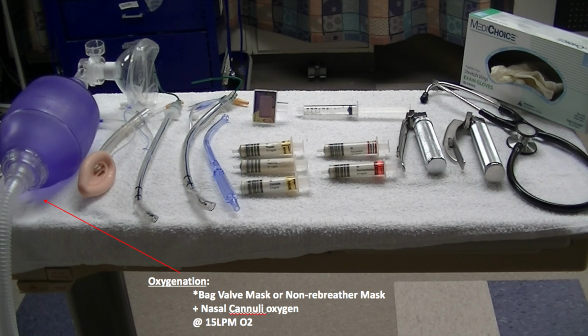In addition to this, you should place the nasal cannula on the patient and have oxygen cranked to its maximum at 15 liters per minute. Using a nasal cannula in addition to a mask will allow you to maximize the pre-oxygenation step.